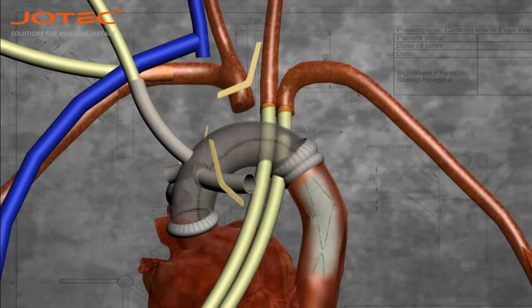Cannulation through the perfusion branch of the vascular prostheses. Restart of systemic perfusion. The selective anterior grade cerebral perfusion is still running through the cannulas.